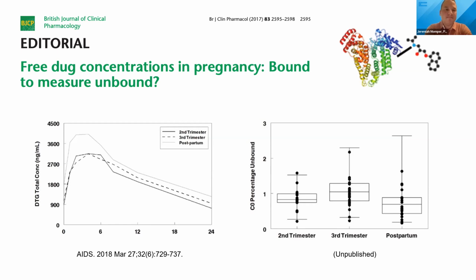So yeah, just a quick plug to consider from an analytical perspective, consider measuring unbound concentrations when possible in pregnancy studies. This is often done with equilibrium dialysis as the gold standard, but can also be done with ultrafiltration.